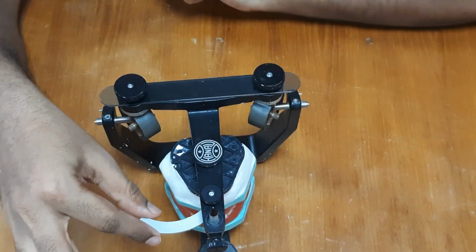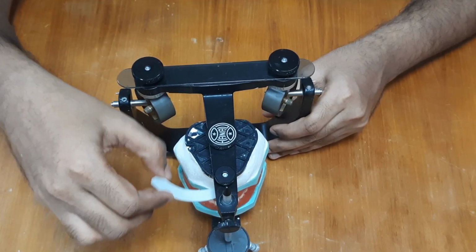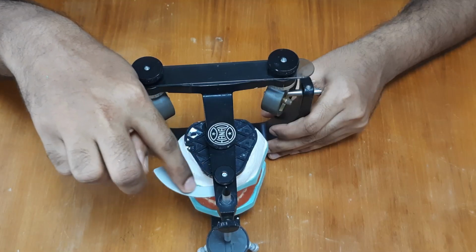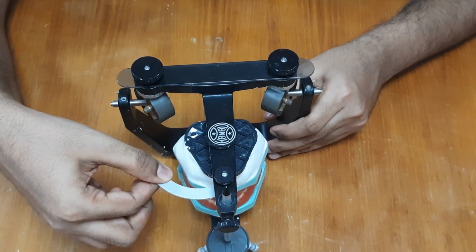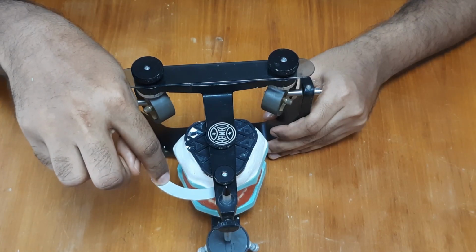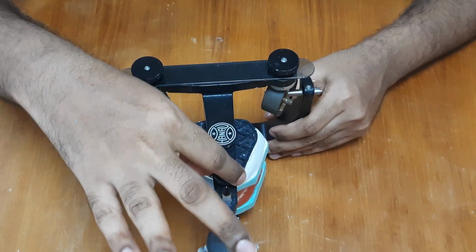Near these dowels is the orbital indicator. This orbital indicator is a curved metal shaft. It is the anterior reference point for the articulator. The orbital pointer of the face bow should contact the orbital indicator during articulation. It can be tightened with a thumb screw.